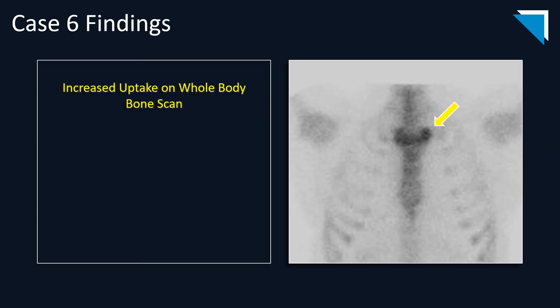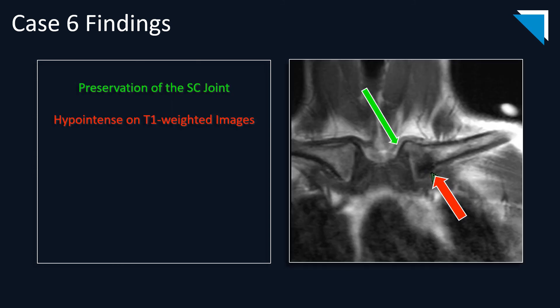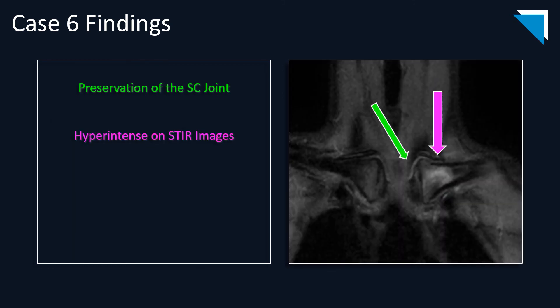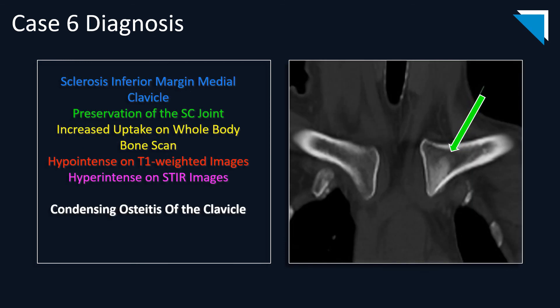This second patient also underwent whole-body bone imaging demonstrating increased uptake within the medial left clavicular head. On MR imaging, the area of sclerosis is hypointense on T1-weighted imaging with preservation of the sternoclavicular joint. On STIR imaging, there is intense marrow edema surrounding the area of sclerosis. The diagnosis is condensing osteitis of the clavicle.